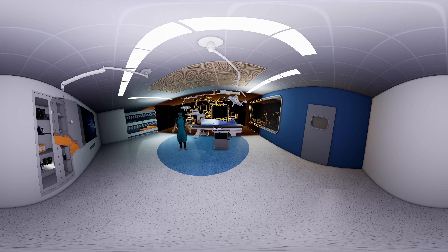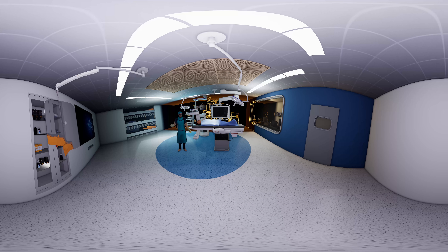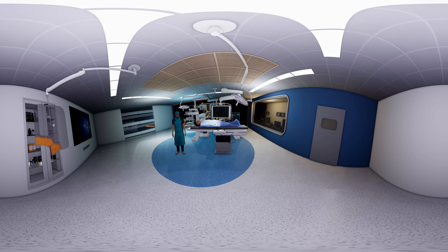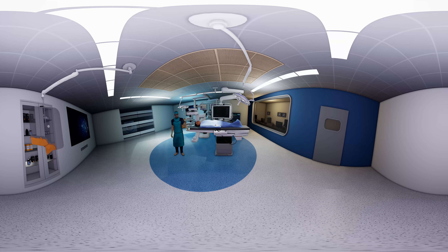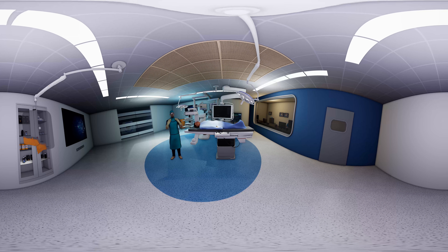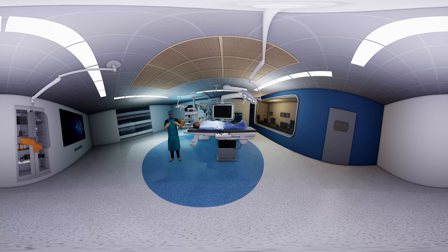I'm wearing Mavic's x-ray personal protective equipment. I'm protecting my eyes using goggles with an integrated dosimeter to control my exposure within the allowed annual limit. This is a head cap to protect the skull region. My thyroid is also protected by a collar shield.